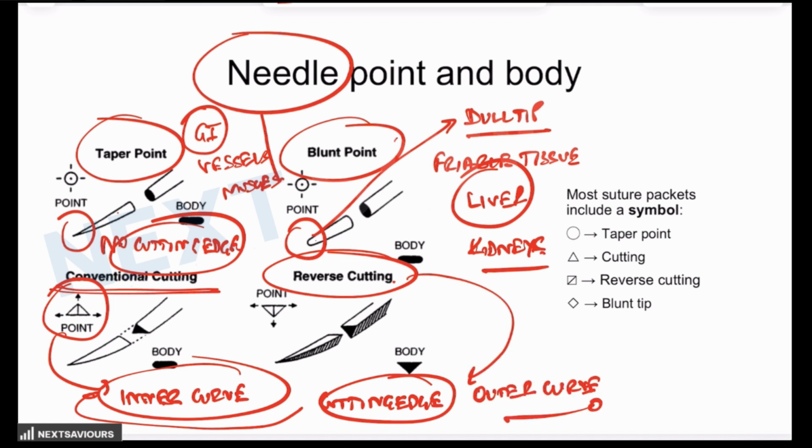Both of them are used for suturing tougher tissues like skin, subcutaneous tissues, or tendons. So hopefully you have understood that needles are basically identified by their points.